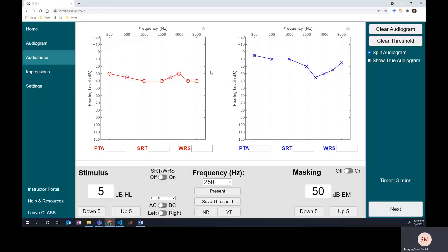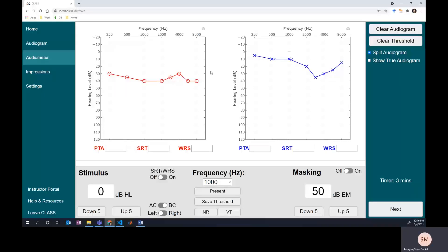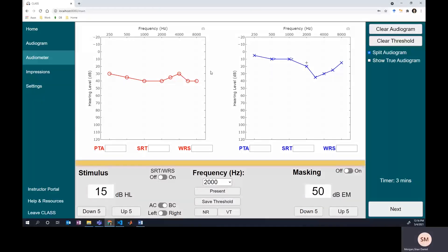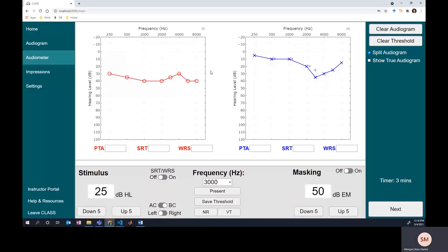So let's split this back out and do some bone conduction testing. We'll start in the left ear, because that's our better hearing ear — we know that now. There's no need to start super high above the threshold because the air and bone conduction scores usually line up, and if they are different it's usually that the bone conduction is better than the air, not worse. So I'll usually just do five above the air conduction threshold and then go down by 10 until I find the true value. Bone conduction responses are super variable at really low and really high frequencies, so we usually only test at these frequencies.